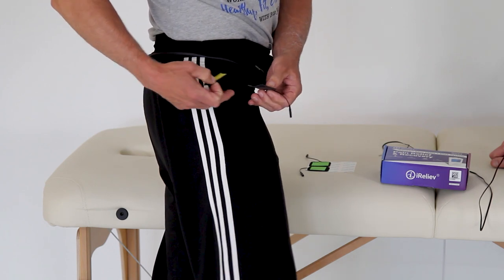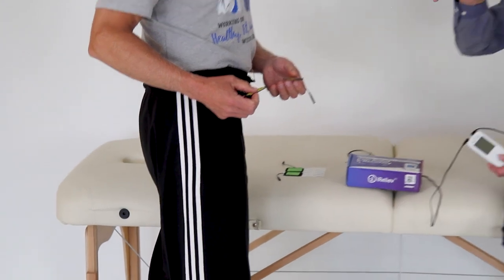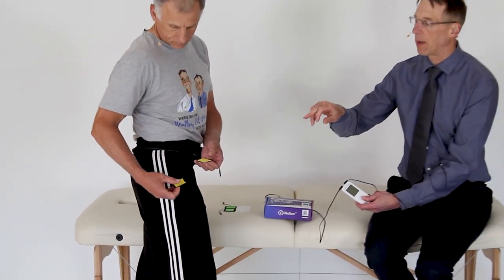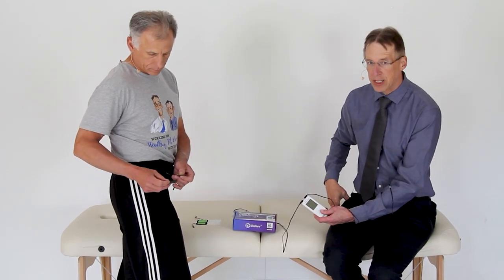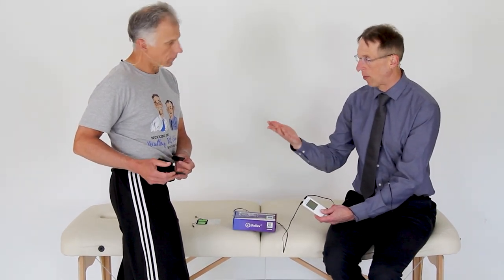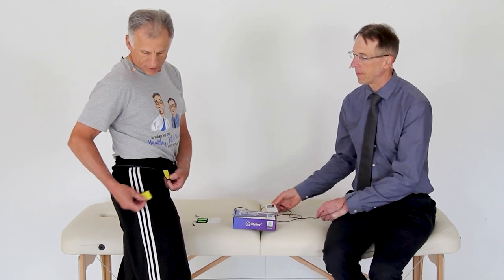What we failed to say here, Brad, is that there's really no absolute correct way to put the pads. You're going to want to experiment to figure out which one works best for you. You may want to try two pads. You may want to try four pads, whatever works for you. Now, that was one pad right over that painful area.